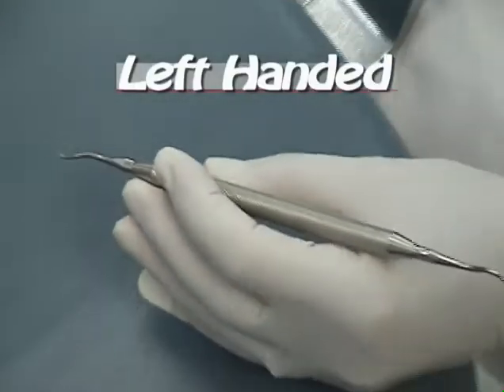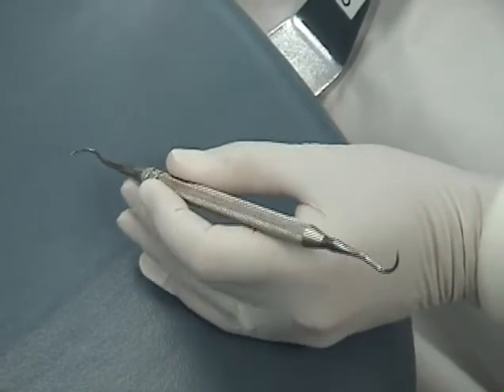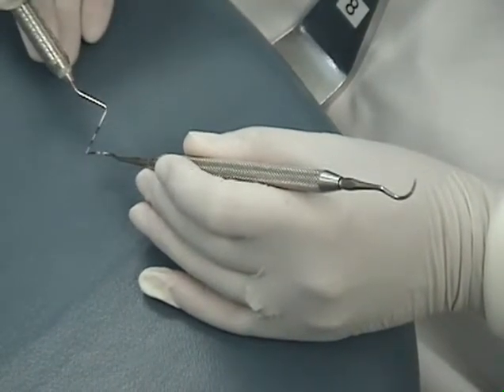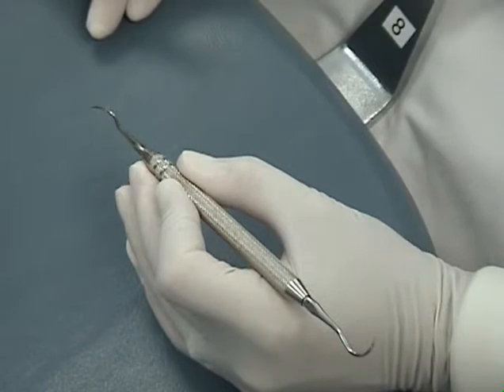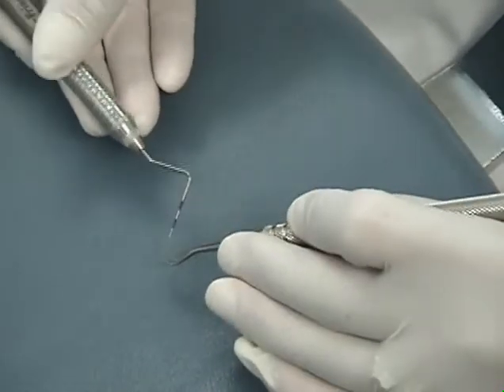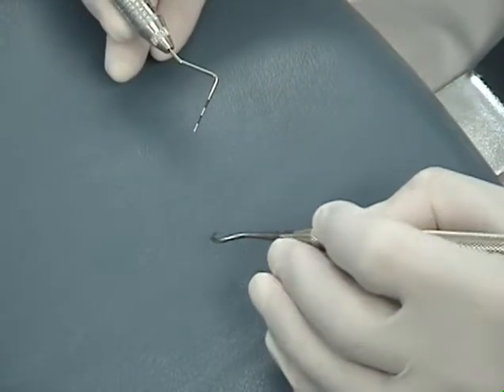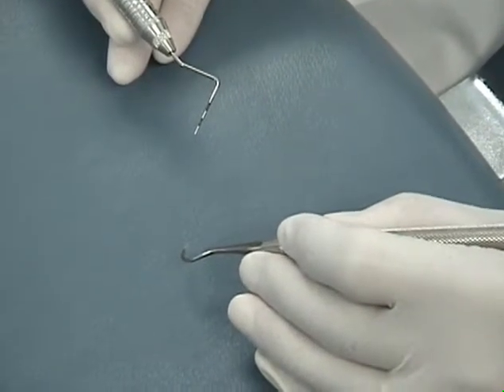Anterior Sickle, Left-Handed Instructions overview: the main purpose is to remove supragingival medium to hard deposits on anterior teeth. The sharp pointed tip helps access fine deposits under the contact area. Grasp: modified pin grasp. Adaptation: lower one-third of the cutting edge — very important since the anterior sickle has two cutting edges. Stroke: moderate to firm lateral pressure, short pull stroke, calculus-removing stroke. Working angulation: 70 to 80 degrees.